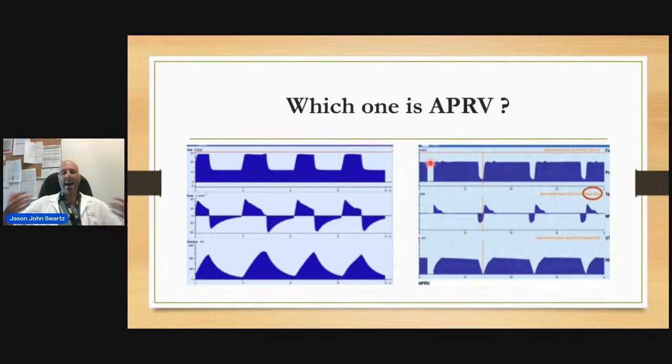And even if they're passively being ventilated, when you're in that P high setting, you have oxygenation occurring without chest movement, but you also have diffusion of CO2 into the alveoli during that P high setting. So when you do release that ventilation, that CO2 is heavily concentrated during that release because it hasn't spent 0.7 or 0.8 inspiratory time like conventional.